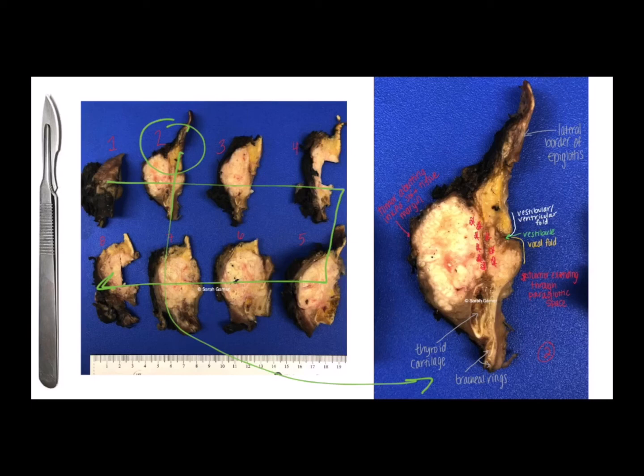And the other hint that you know that this is paraglottic and not pre-epiglottic is because you can see those chords. On here I've labeled the true and false chords, as well as that, oops, I put vestibule, it should be ventricle here. And you can see that it's at that level. So you know that this whole area is going to be that paraglottic space. And you can see that tumor is extending directly through there, which is where I put all of these red stars. And importantly, it also extends all the way to that soft tissue margin. The soft tissue margin is inked black here, and you can see that that tumor is abutting it at least, maybe even extending through it.